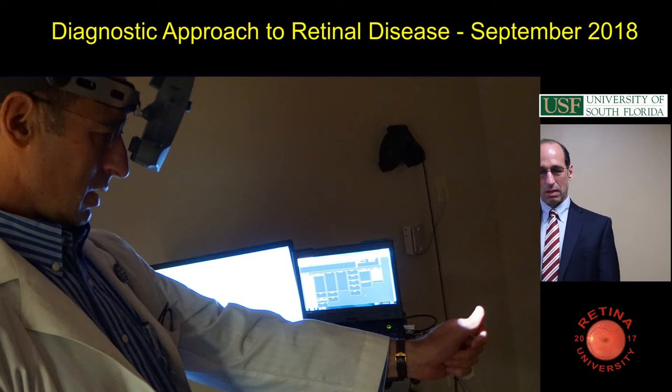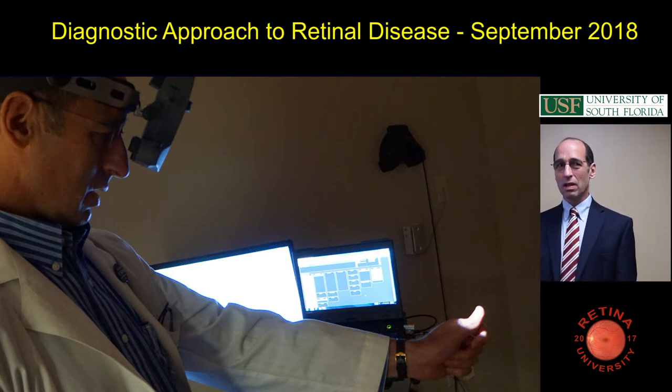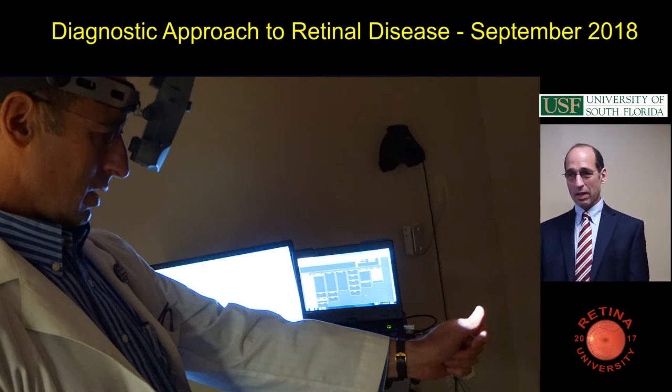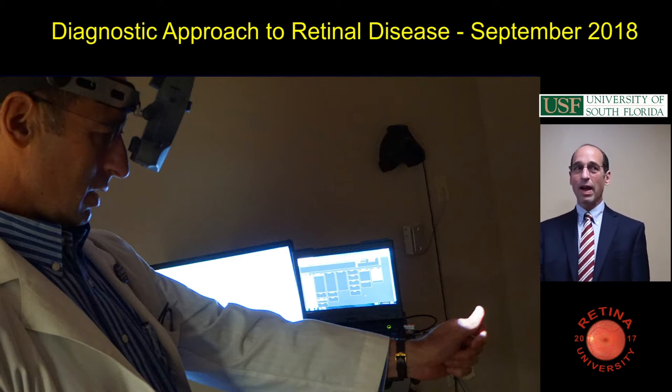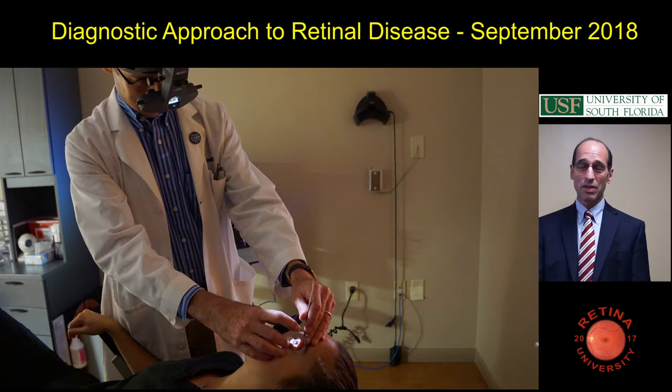So that's ophthalmoscopy, which is considered part of the testing, and you'll get better. It's all learnable. The more you do it, the better you get at it. Even in my medical retina year, I had trouble looking at a surgical retina eye for pathology through a gas bubble. We have patients with a cataract, a gas bubble, a bubble in the anterior chamber, and you're trying to see the retina. It just is really hard.